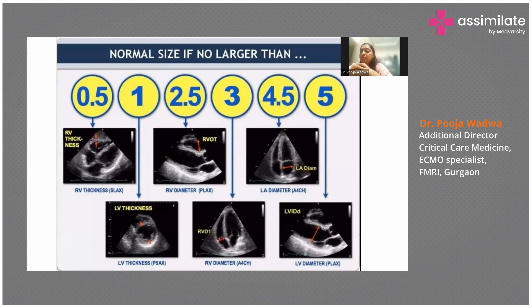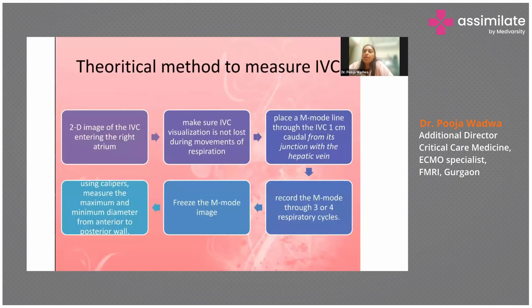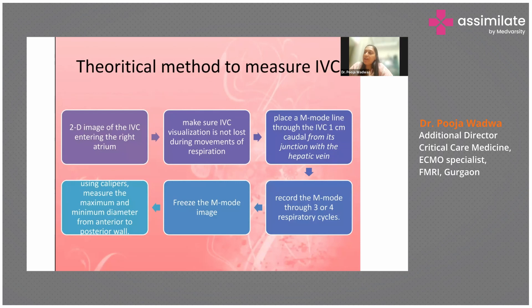How do you assess the volume status, IVC, and its preload responsiveness? You initially have to rely on a 2D image of the IVC entering the right atrium — focus there. Make sure that it is the IVC; you should see it even when your patient is breathing, that means during the movements of respiration. When you have a good view, only then place it on the M-mode through the IVC.